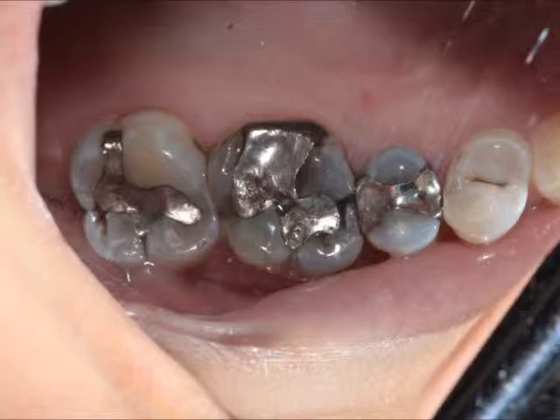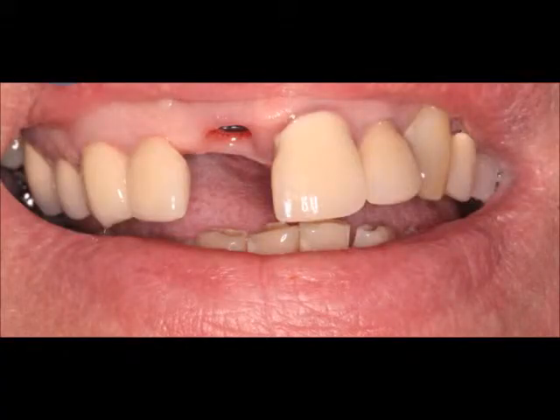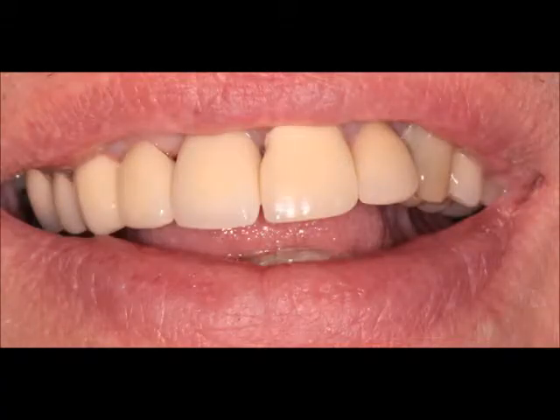Here are some examples of some teeth that we've made with the CEREC system. You can see how natural and lifelike they look. There's no ugly metal to show, and they look just like your real teeth.